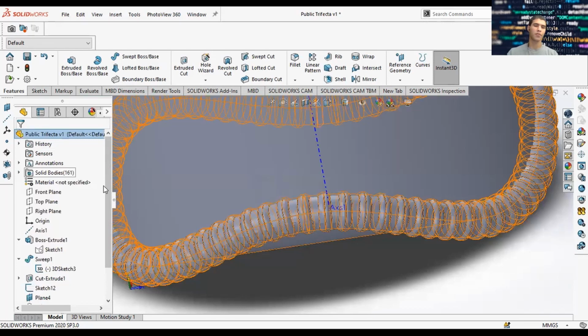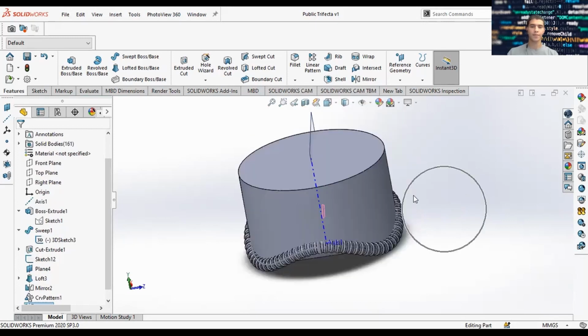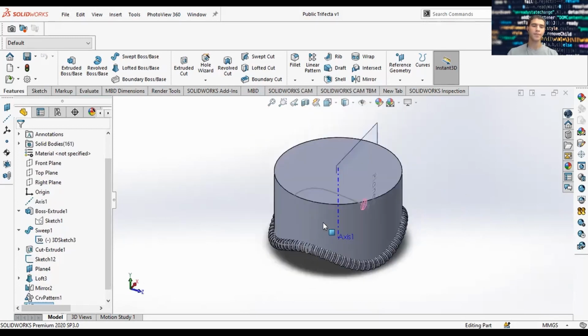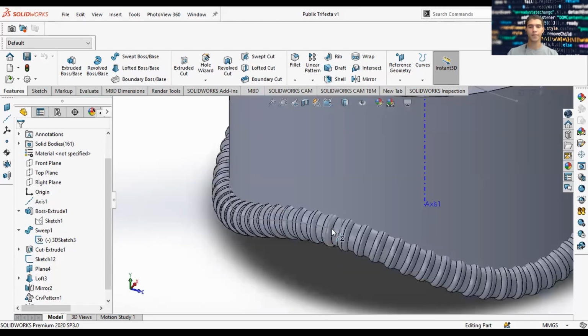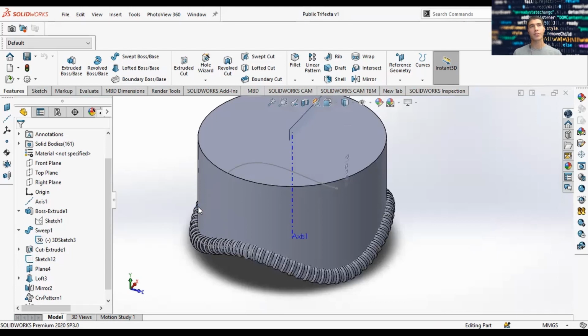And so now you'll notice your family tree is starting to get bigger. Let's do a quick save. So just to summarize what we've done so far, we've done a curve equation-driven curve to simulate the outer cuff of this annulus, this heart valve, and we included the details by incorporating a loft function and then mirroring along the axis or along the planes.